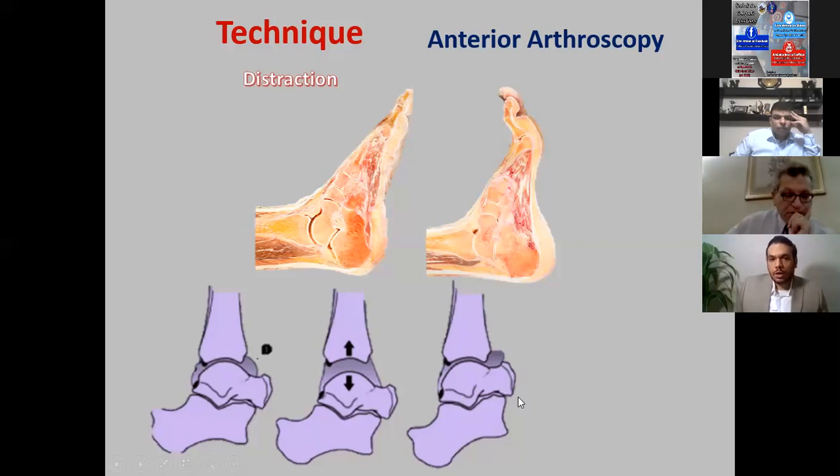So most surgeons now rely on the dorsiflexion method that increases the anterior working space, allows safe and greater access to the anterior joint space using larger instruments, and allows better visualization of the gutters, but sometimes it's difficult to reach the most posterior regions of the talar dome, like we discussed with the previous lecture.